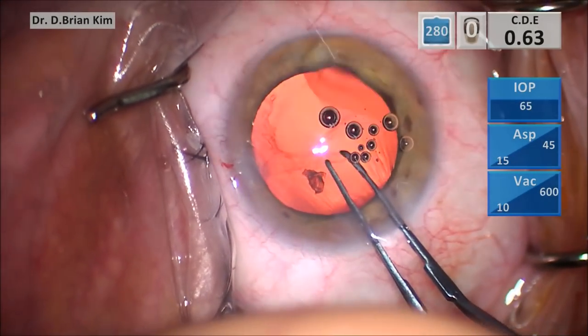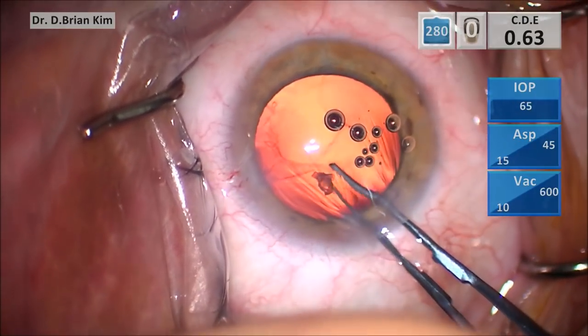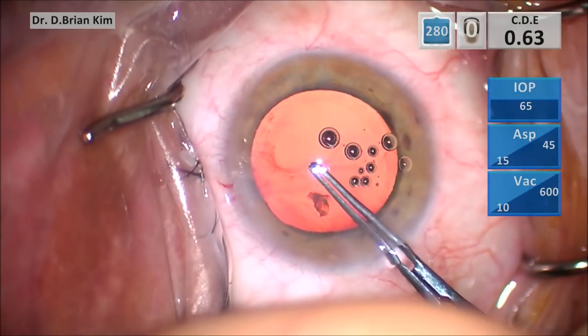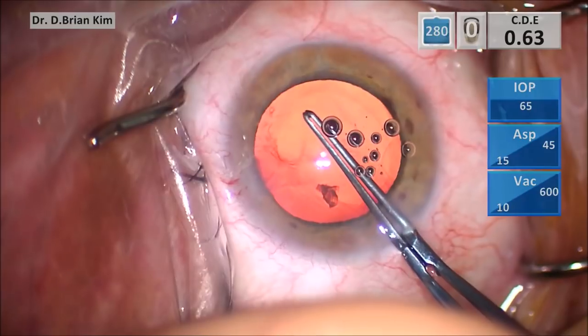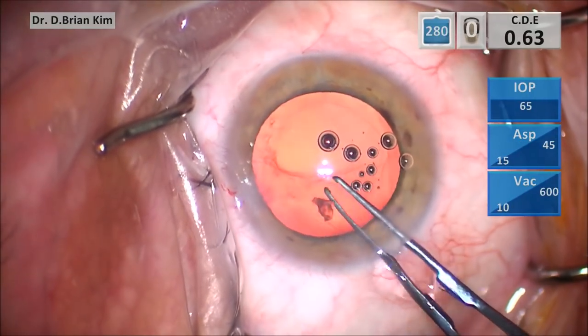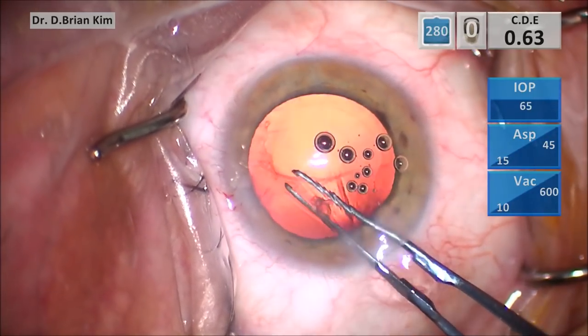Now, I see this is a fairly round tear. And I want to make sure it doesn't have any jagged edges. So I'm going to attempt a posterior capsulorhexis. As you can see, the posterior capsule is very thin and it's folded up here, and it's still intact inferiorly, but I don't want that to tear and split any further.